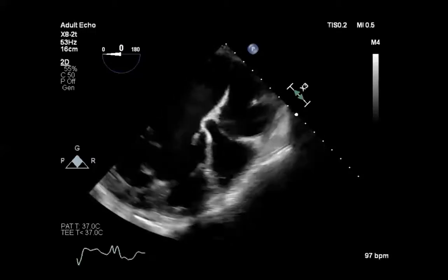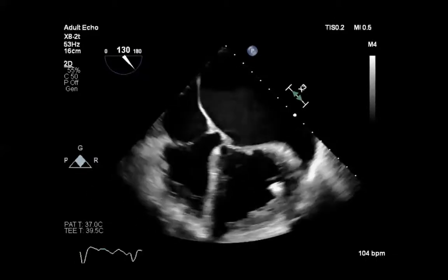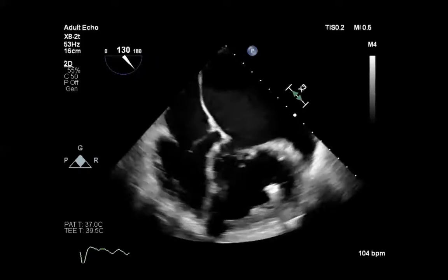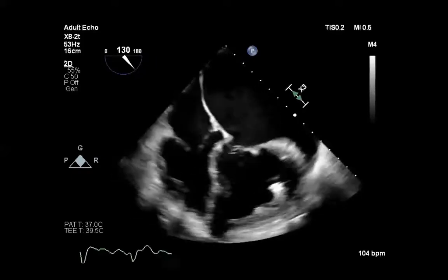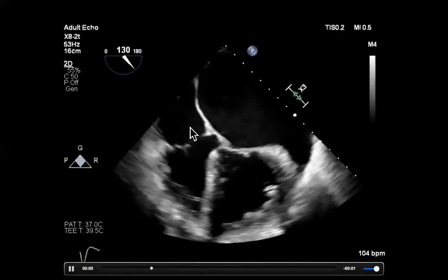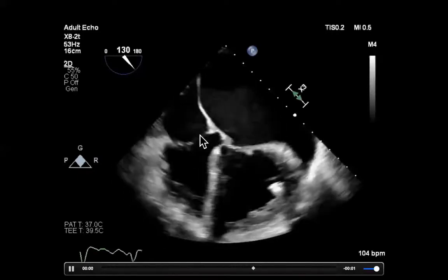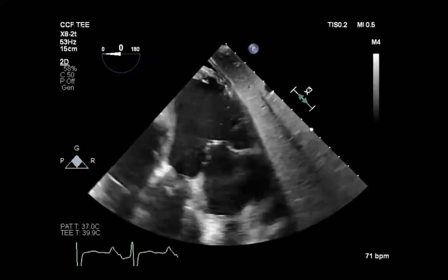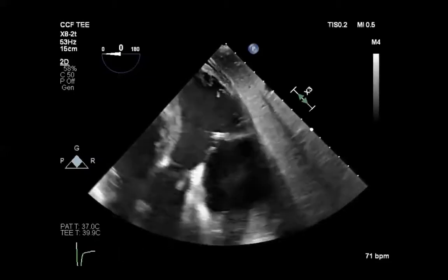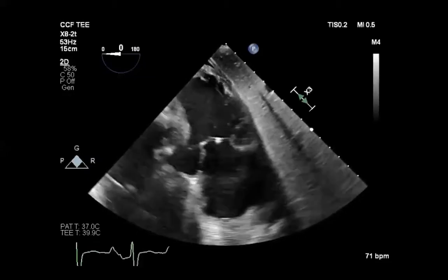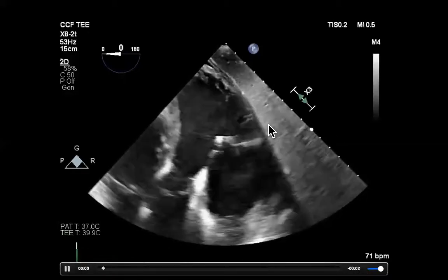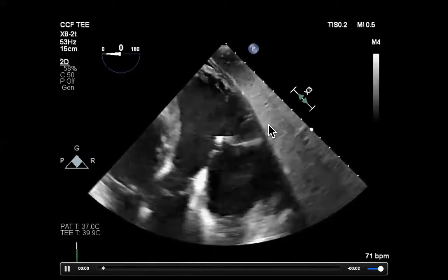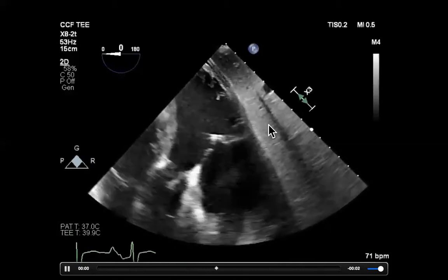The anatomy looks very, very abnormal. Then you advance the multiplane some more and get another sort of four-chamber view, but it's still very hard to differentiate the heart chambers — what is right atrium, what is left ventricle, it's really hard to know. Then you go deep into the stomach and get this view, and you realize that to make things even more difficult, the liver is on the left side of the patient because of the situs inversus totalis. So the TEE examination for this patient with this anatomy is going to be very challenging.